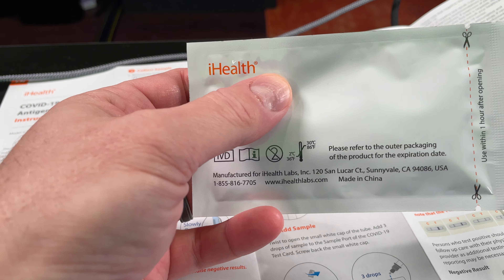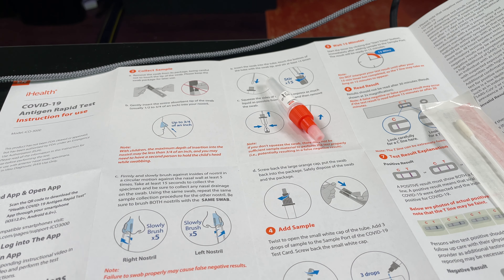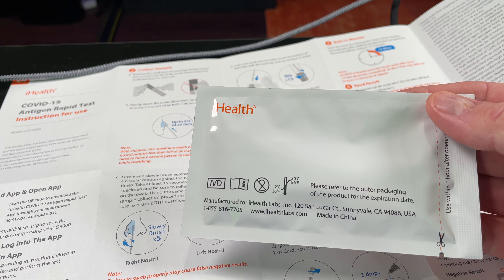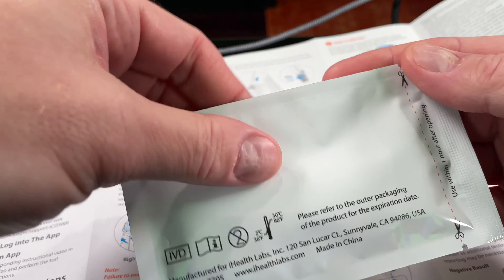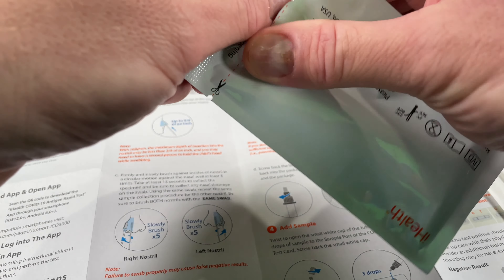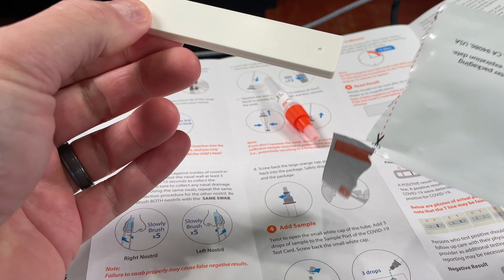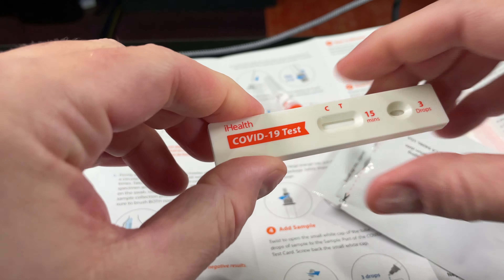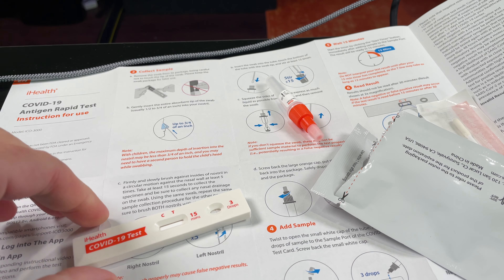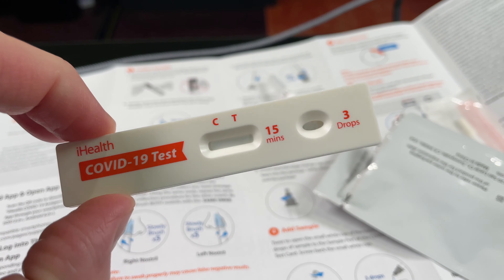This right here is called the iHealth — this is the particular kit I'm going to use. It says prepare materials, open the package, take out the COVID-19 test card. I've been using another type and this is my first time using this type. That is fancy.